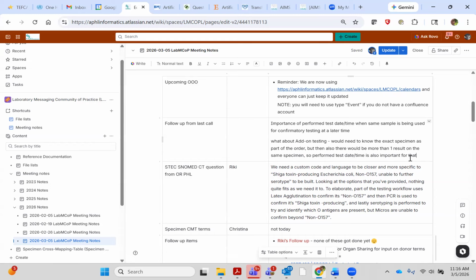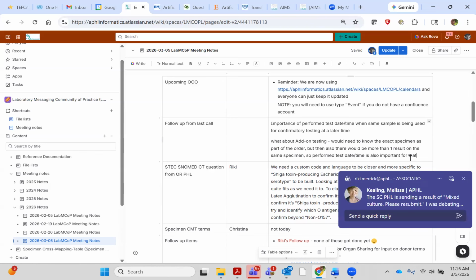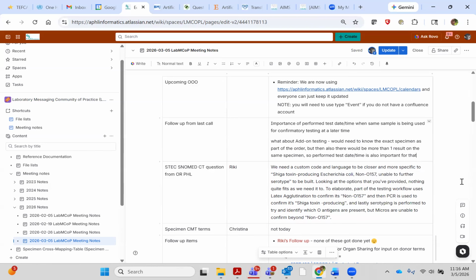The other thing is, say you're doing protein electrophoresis, you do your total protein on your chem analyzer. That might be done on day one, when the specimen is drawn, but you might miss the cutoff, or it comes in the evening, for doing your electrophoresis testing. So maybe that's done on day shift the next day.